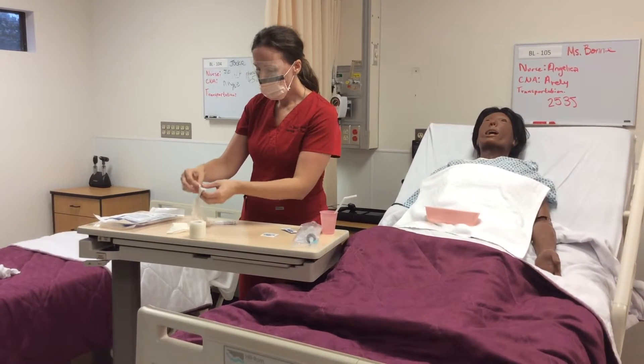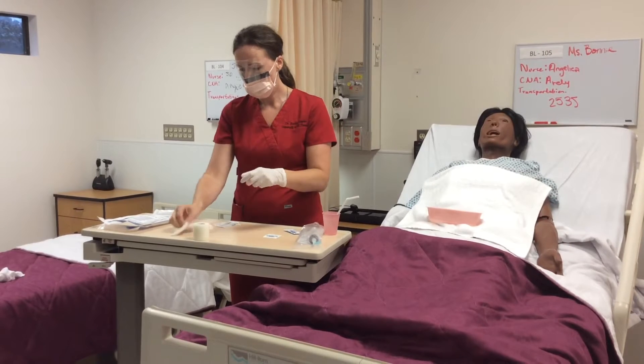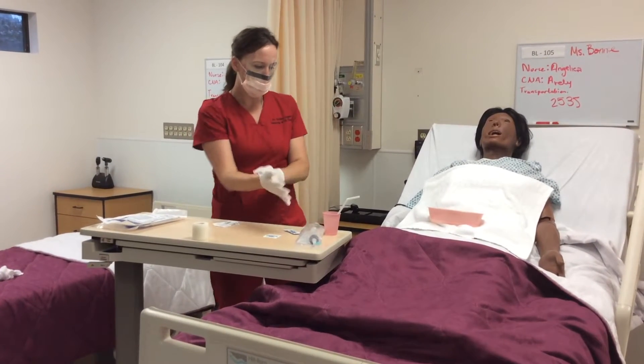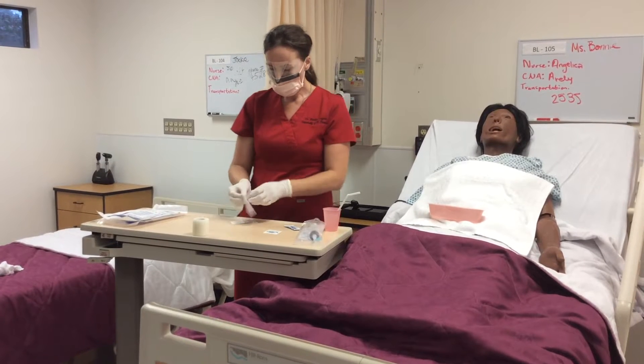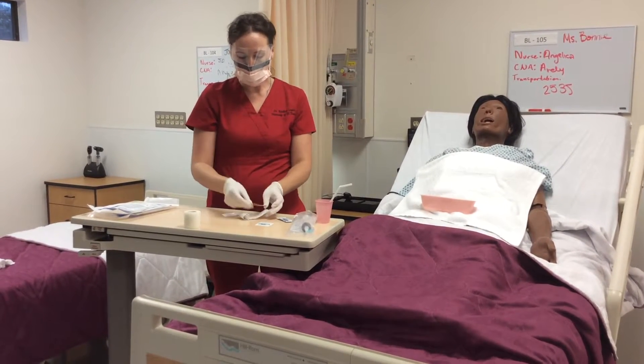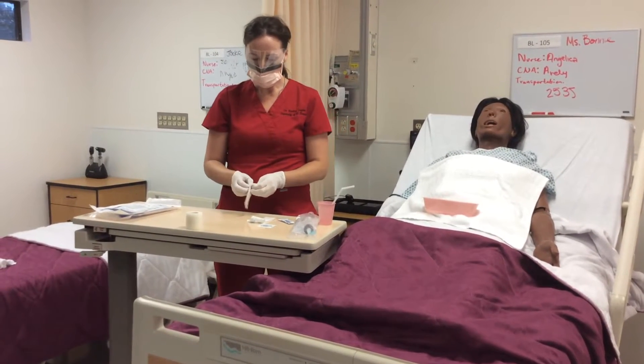I've got my lubricating jelly and I'm going to apply my gloves. I've prepared my water with the straw. When it comes time to use that, I will either need an assistant or I can ask the patient to hold it if they are able.